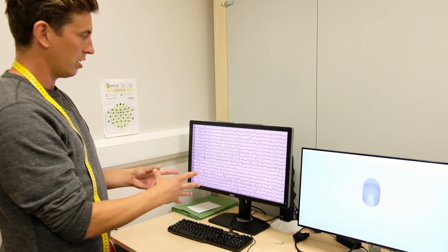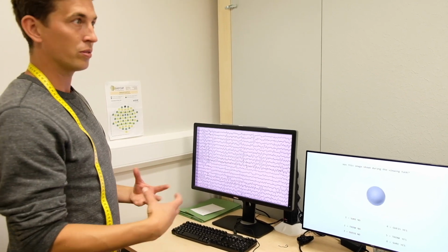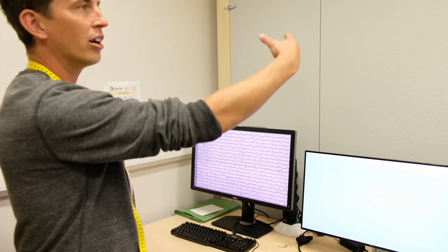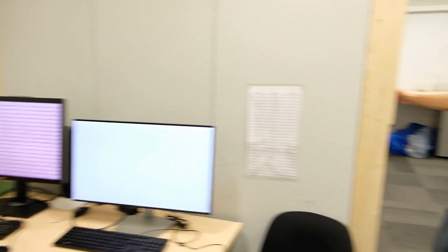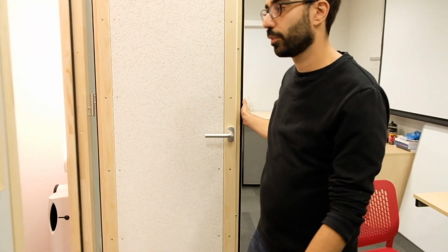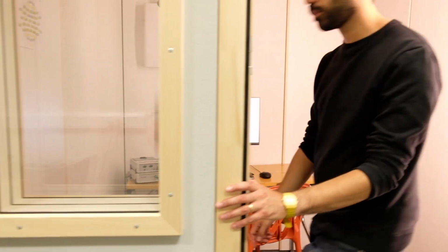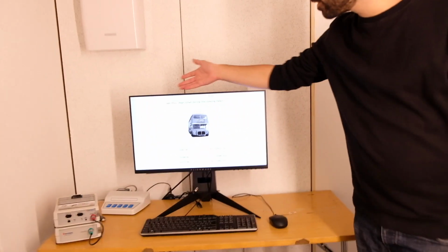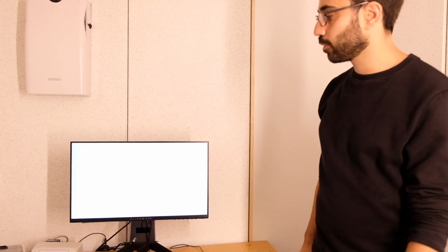So this is where the experimenter will be sitting, the recorder if you want, and then they are linked. So if John opens up the cubicle, our participant, who would have been set up on the outside here and have their EEG cap placed on the head and ready to go, will be sitting inside this sound attenuated booth. Importantly, we have a glass pane, so we can look straight through and make sure that the participant is okay if we need to.